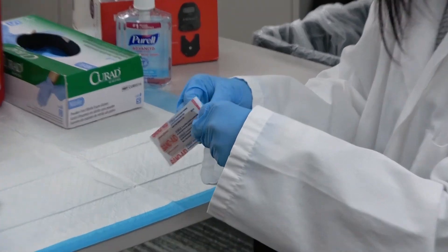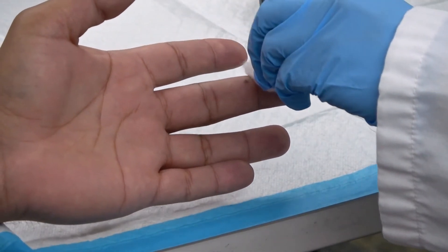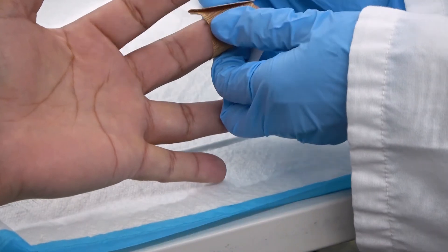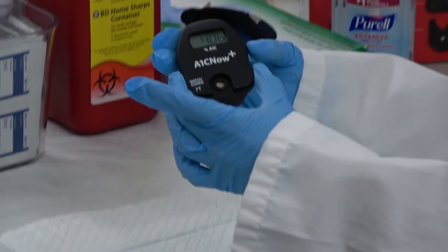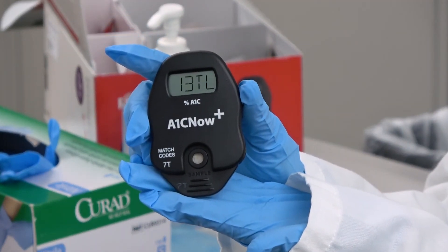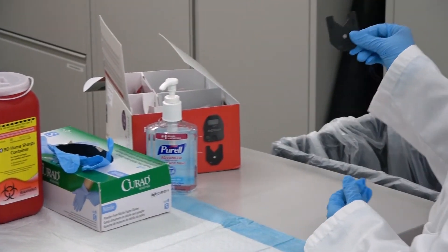Open and provide the patient with a band-aid. Allow 5 minutes for the A1C meter results to appear. Discard any trash and throw away in the regular trash bin.